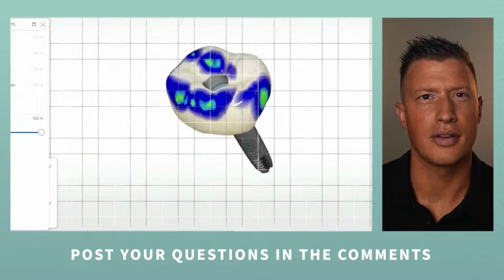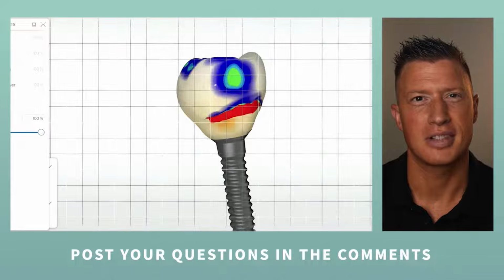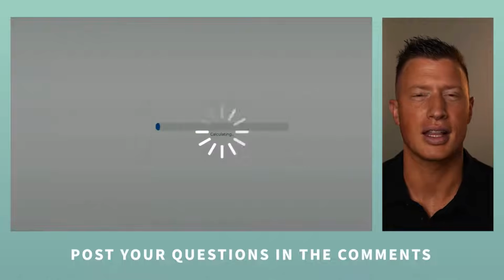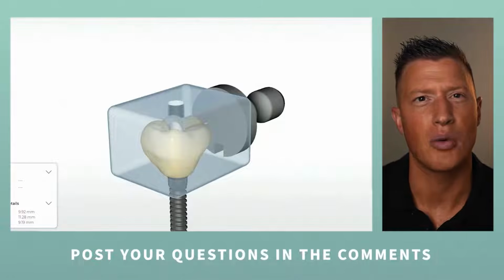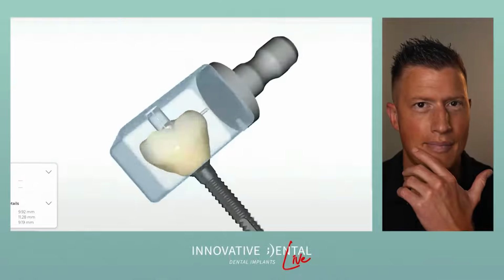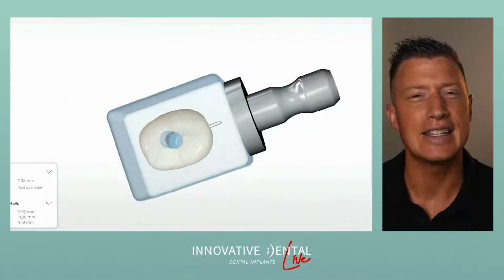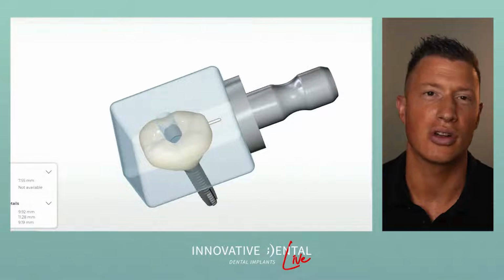So I know this is a lot of information for maybe somebody who just says, just do it for me. But I know there's those of you out there, I've seen it in our comments and on our YouTube channel, that like to know a lot of stuff. So that's why we do these lives, a little bit more of a deep dive into how we make dental implant crowns and dental implants. So I kind of guided you through the whole process here of how we can make a tooth that didn't exist and give you one to be able to chew and protect your other teeth.